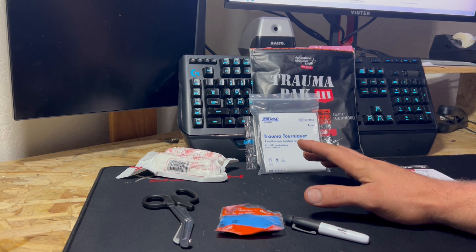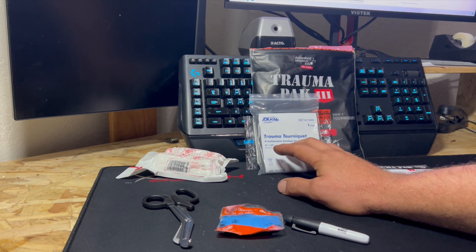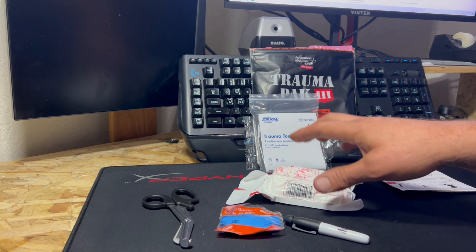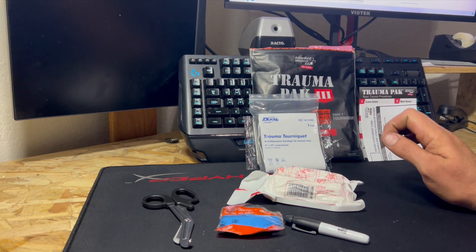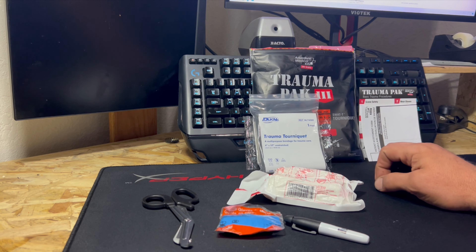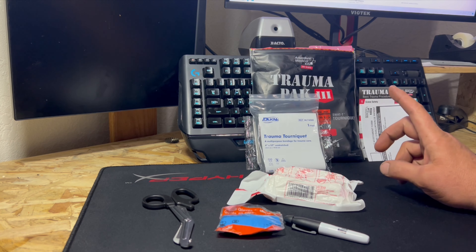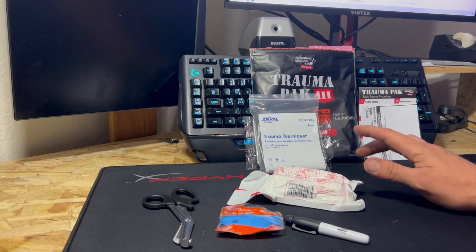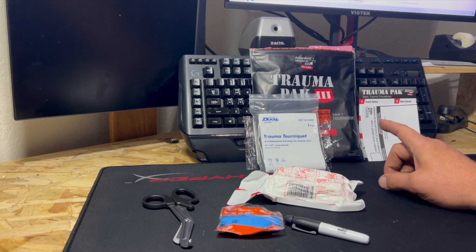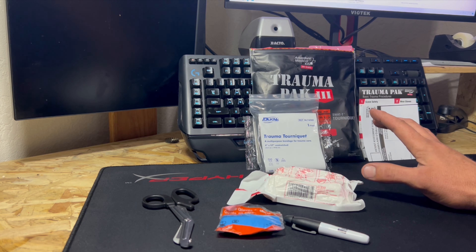This is a four inch by 57 inch unstretched rubber tourniquet. It's a great starter kit because it allows you to cut off blood flow if you need a tourniquet, and it also lets you apply direct pressure to a wound. So it's a pretty basic kit. On Amazon this kit runs $39.99 when it's not on sale. You also see these at sports centers and hunting stores ranging between $40 and $60, but we're going to use the $40 Amazon price as our starting point.